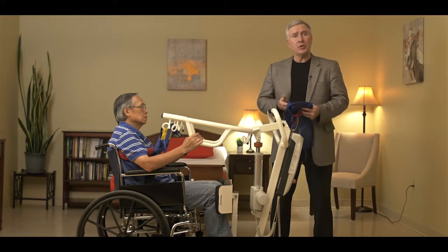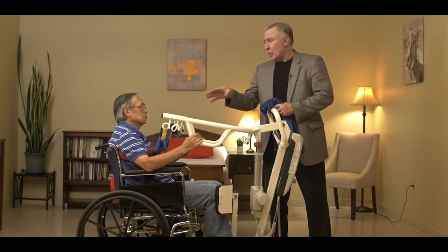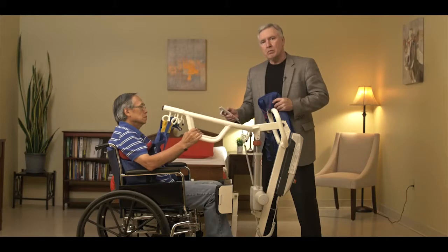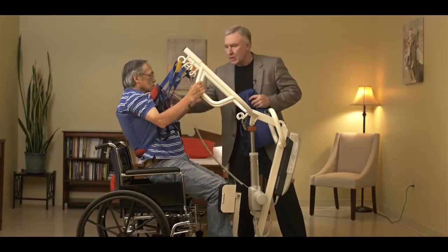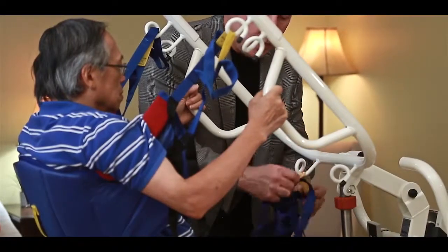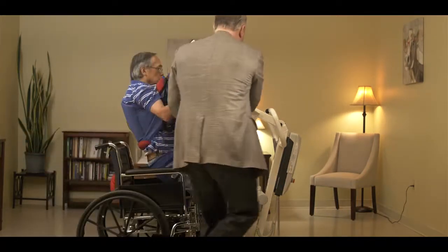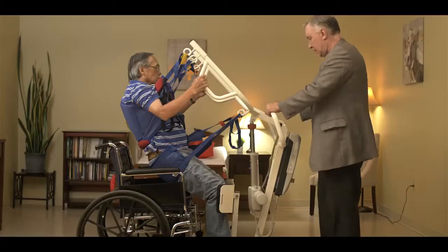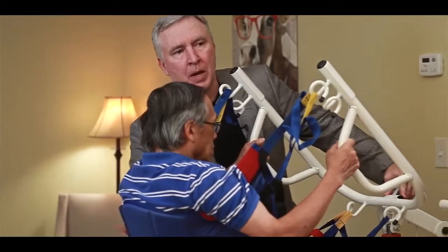Now it's time to show you how to use the buttock support strap with the SA family of sit-to-stand products. Right now the patient is in the lift with the standard support vest behind their back. This product provides additional support if the patient has a tendency to slide down through the sling during the transfer process. I'll go ahead and raise the patient as normal — as the patient starts to raise up into a standing position, there's a possibility they can slide down. The buttock support strap simply connects to the first set of hooks; it has multiple loops to adjust the length. Bring it around the bottom and connect it to the other side. With this additional support, we can minimize the possibility of the patient sliding down in the sling.